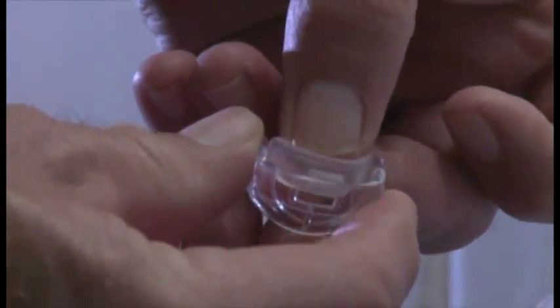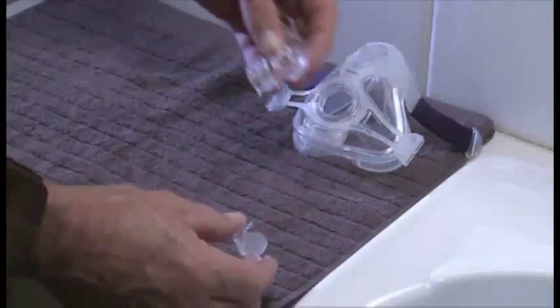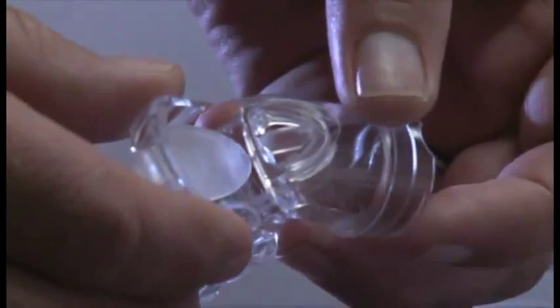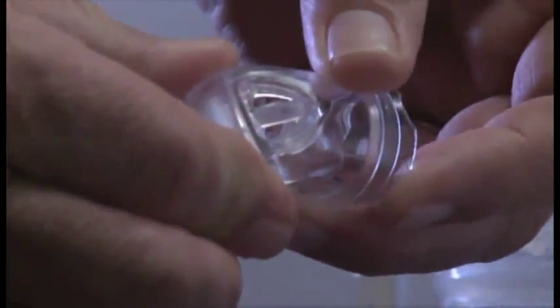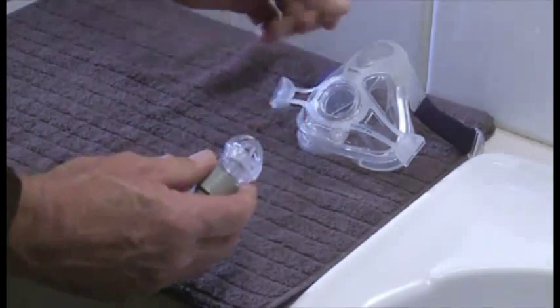To reassemble the elbow assembly, insert the valve into the clip and push the valve clip onto the elbow. Attach the swivel to the end of the elbow and attach the elbow assembly to the mask.